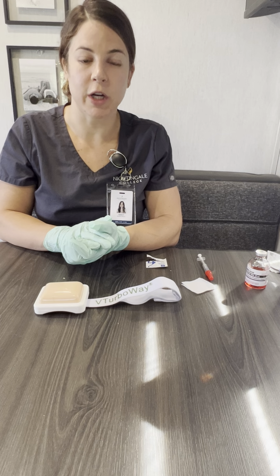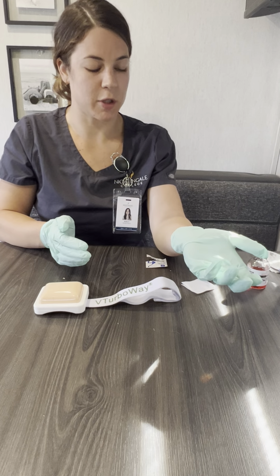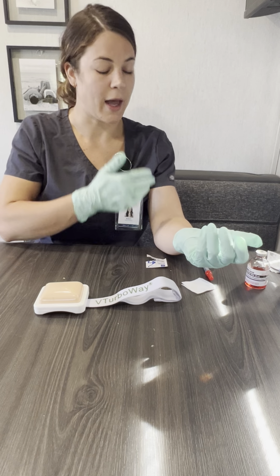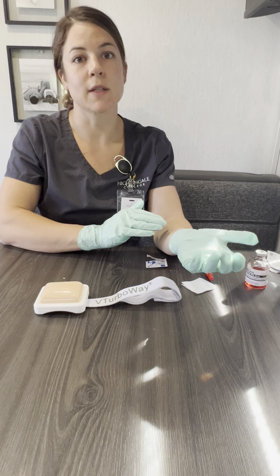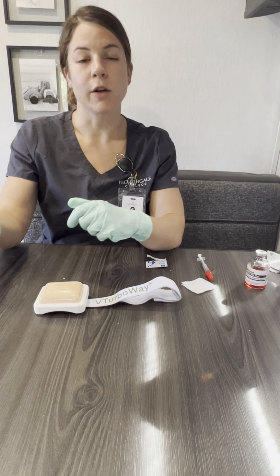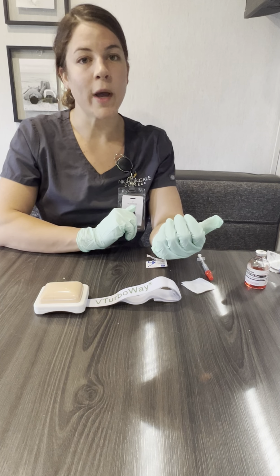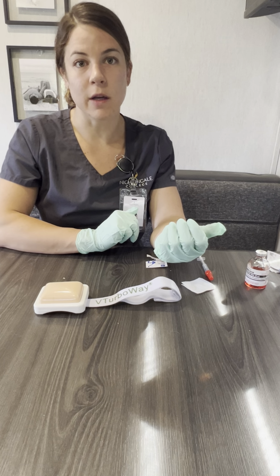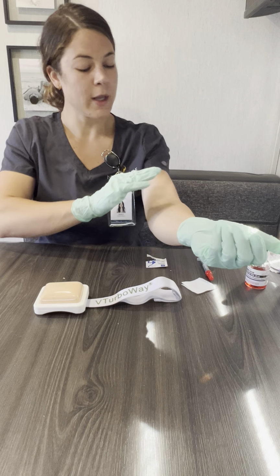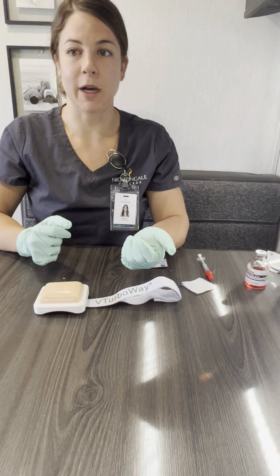So for this injection specifically, we're going to go ahead and choose the forearm. If the forearm wasn't a good option due to maybe a cut, a bruise, a lesion, or they had a vaccine of some sort on this arm, whatever you couldn't use, sites could be on the back, or your opposite arm, you would inspect. But for this one, we're going to go ahead and use the forearm. When administering a TB test on the forearm, you want to make sure it's 3 to 4 fingers from your antecubital and a hand from here.